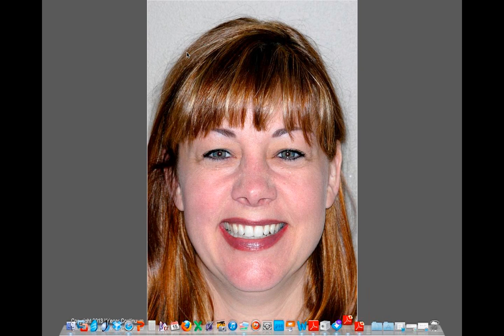You've got the full face smile, and I want the ears out of the way. And I could have done that better in this picture, but I just pulled a bunch out. I want you to recognize it's important to grade your images, and you'll hear me grade my own. I think intellectual honesty is important. If you don't see something you like, be honest with yourself. Don't say, it doesn't matter. Yeah, it does matter, because sometimes the ears can be an important landmark.